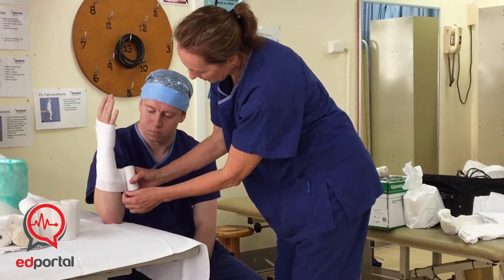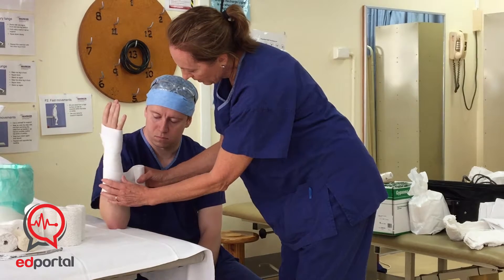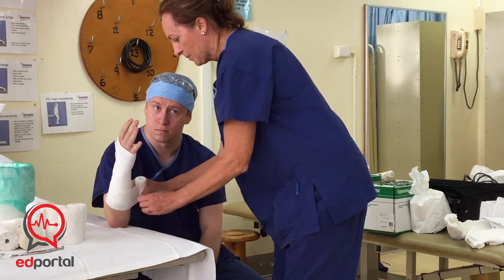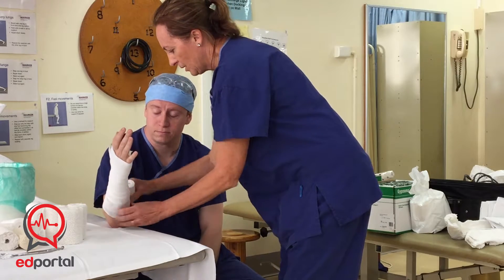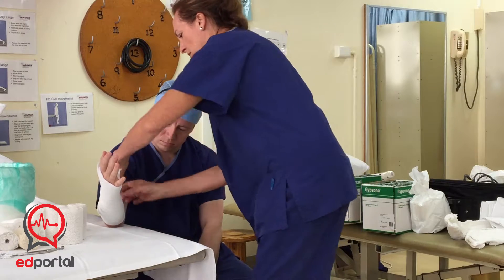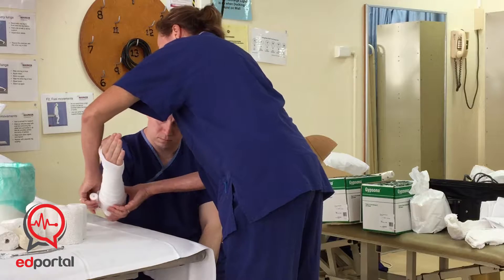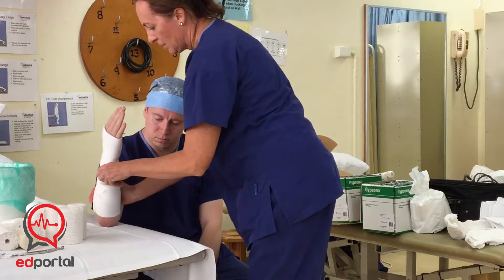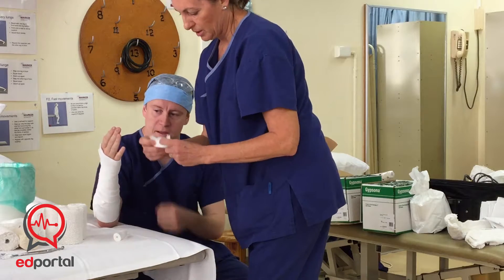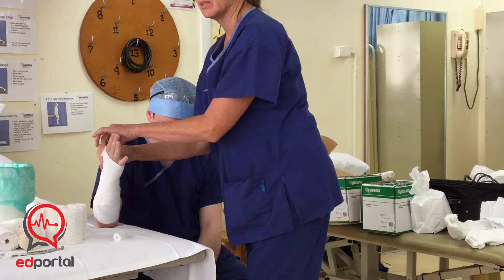To get around the contours, you can just tear it a little bit and pull it, then tuck it neat around it. We're just heading all the way down. Then put another little piece in there just because we don't want plaster against the skin.